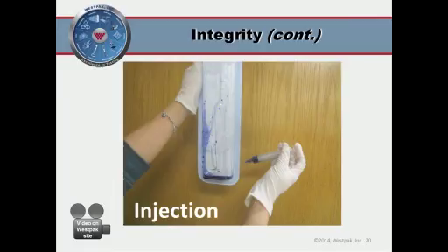Sure. I'd like to point out that the dye that Katie mentioned is called out in the standard. It's a high surfactant level of a material with a horrible purple color. That's my personal evaluation. And it will wick into any small channels very readily.